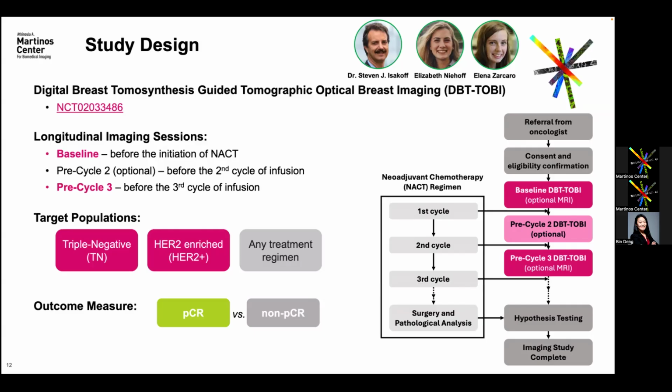Question for me. So basically, when you are compressing the tissue and letting it come back, is your optical imaging just looking at the physical properties of how the tissue is responding to that mechanical force, or a combination of that and other things? So the question is, once the compression, are we looking at the mechanical property changes of the breast or something else?